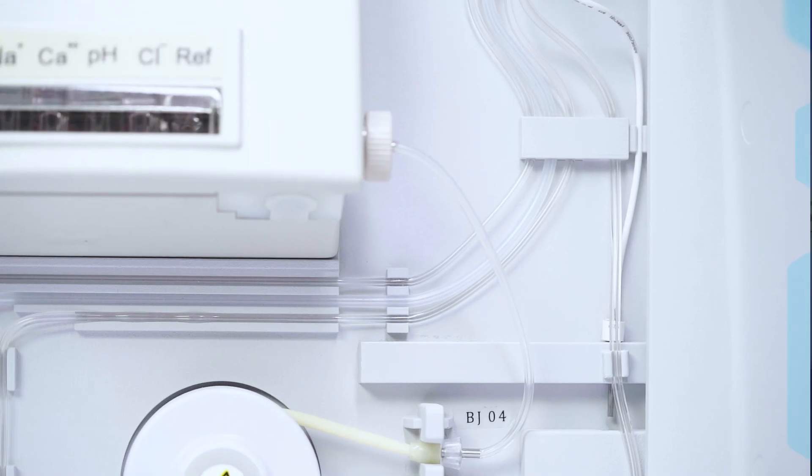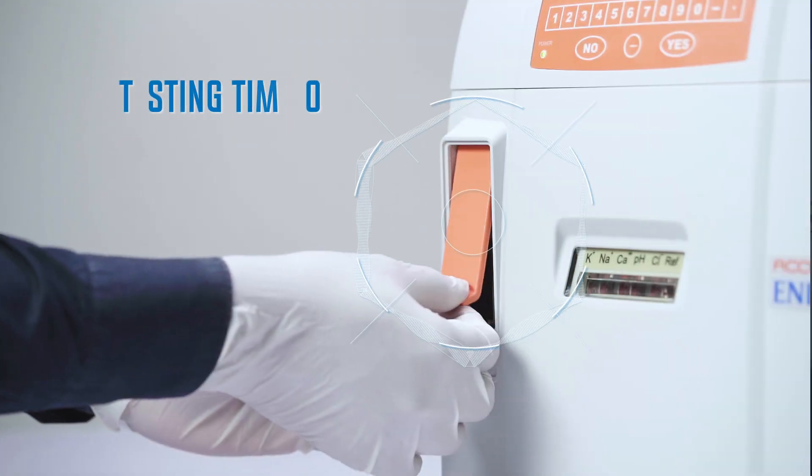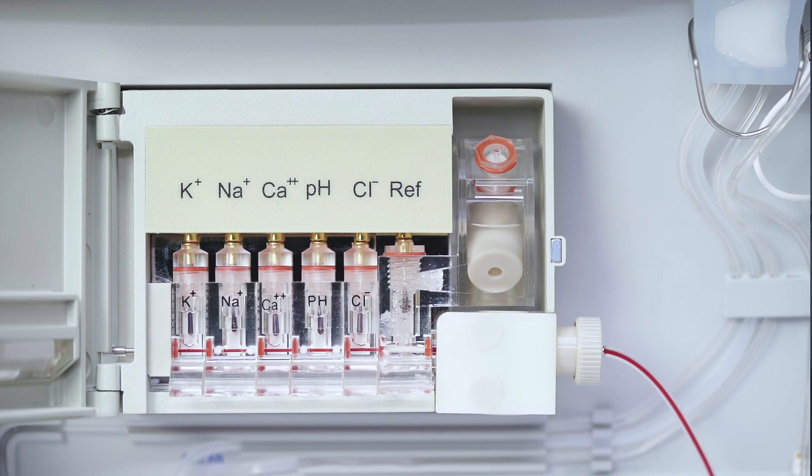The bi-directional washing ensures proper cleaning of the tubings and prevents clogging. With a testing time of 30 seconds per sample, its efficiency is unparalleled.